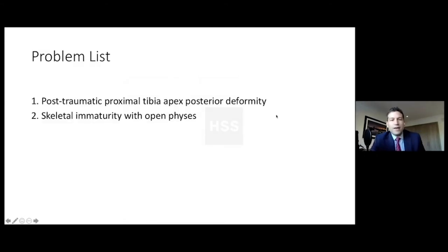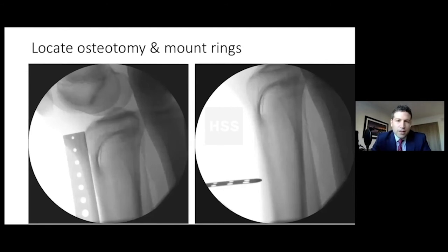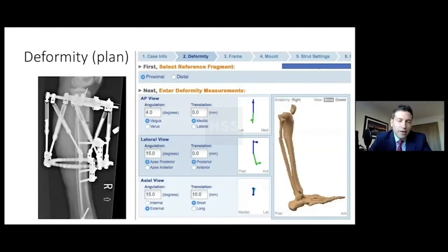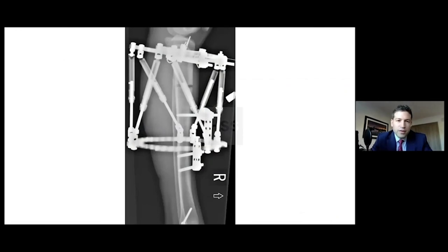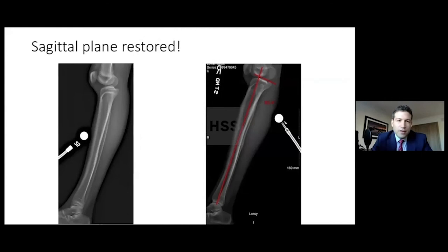She has a proximal open physis, so I don't want to use an IM nail for this. It's sagittal plane, and I like ring fixators — it's easier for me to control this large deformity. So execution in the OR: just mark the osteotomy location, mount a ring fixator, and enter the numbers in a computer — the program will do it for you. For all of you who like hexapods, this is really quite easy because the computer will just generate the program and get the correction for you. Here's her at the beginning, here's after the deformity correction, and here's the final x-rays with a normal sagittal plane restored and a normal clinical exam — because she really did not like this hyperextension feeling. She actually presented thinking her knee was dislocating.